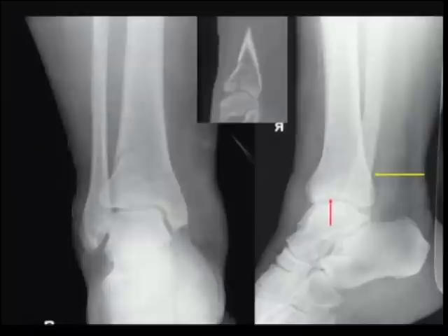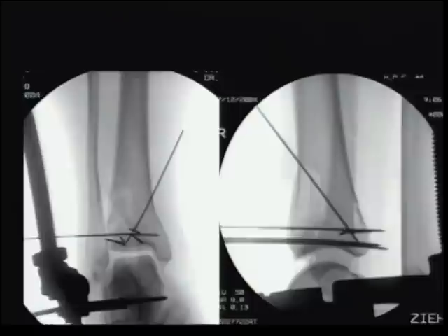But you can see, represented with the yellow arrow, the tension failure on the posterior aspect of the tibia, even in the subtle injury, and the dorsiflexion deformity and the articular step-off, represented by the red arrow. Now you can see at the time of reduction, and this is after an open reduction, the articular cartilage looks to be congruent, but you see this persistent dorsiflexion deformity from the posterior segment.